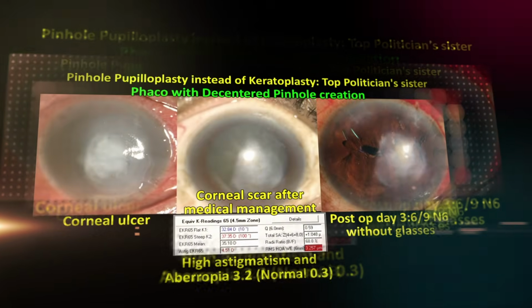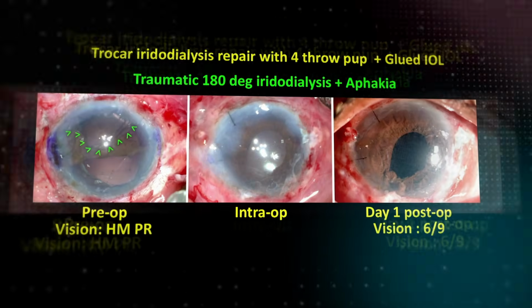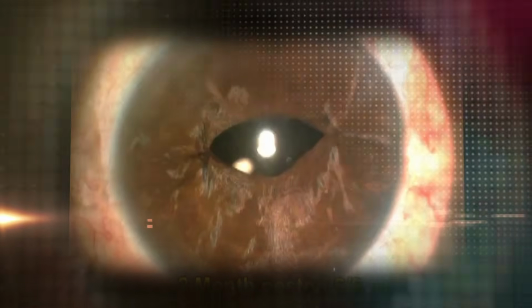Successful pupil restoration depends on selecting the appropriate technique. Each technique addresses a different dimension of pupil dysfunction. Together, they form a complete surgical strategy.